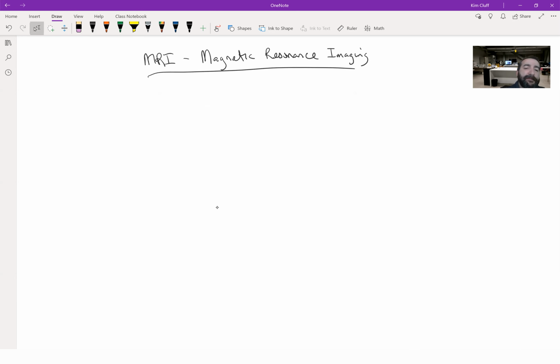Looking at some of the physics, if you have a current, which we'll call I, traveling in a closed loop, as you may recall from physics, anytime this happens you're going to get a subsequent magnetic field, or a magnetic moment.